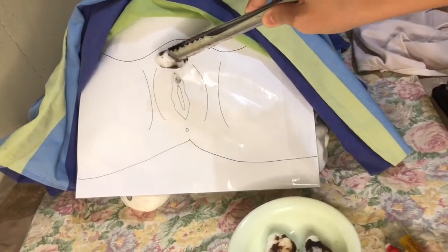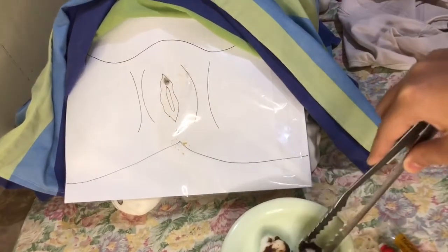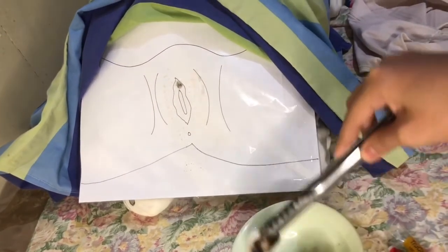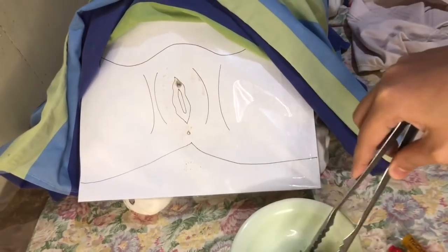Using the sterile forceps, cleanse the area using cotton ball with betadine, which is an antiseptic. Note for particular areas of inflammation, swelling, excessive discharge or secretions from the orifice, and presence of odor.